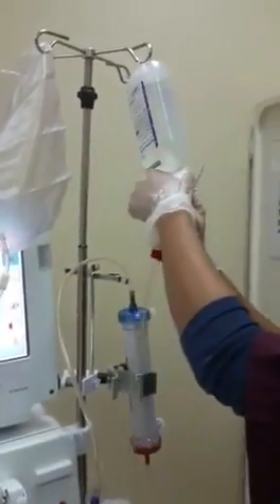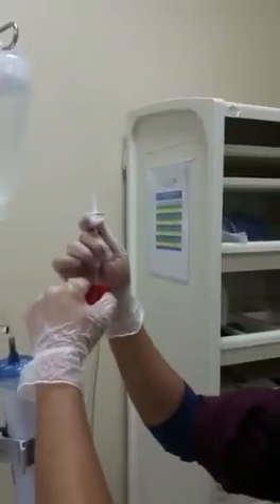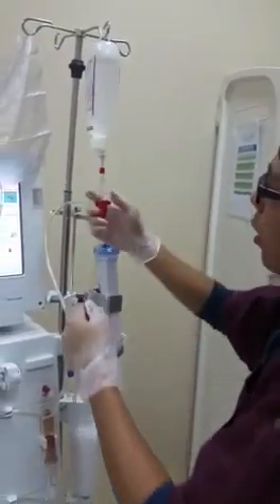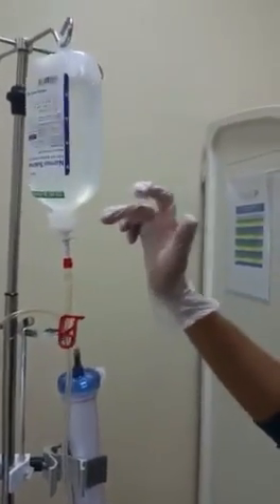Make sure that every loose connection is secured. Then we will connect the normal saline to the arterial line via the perfusor.